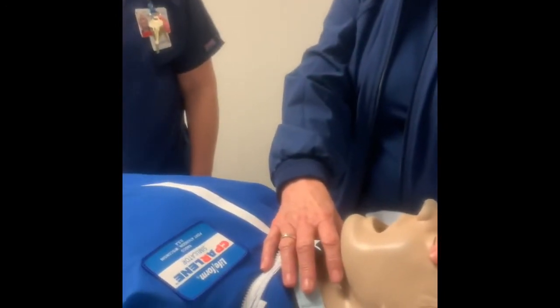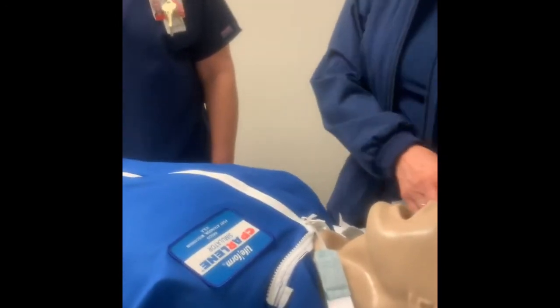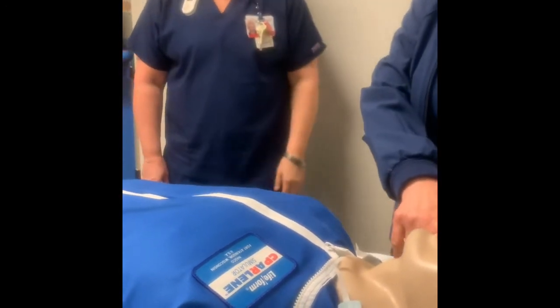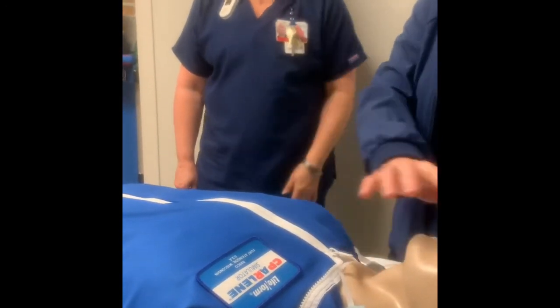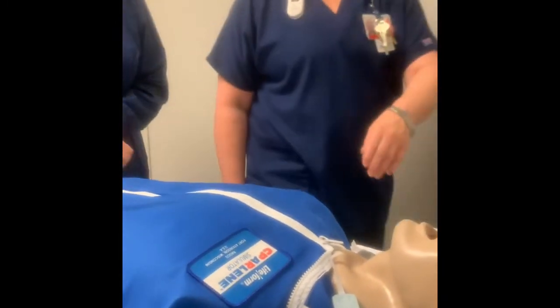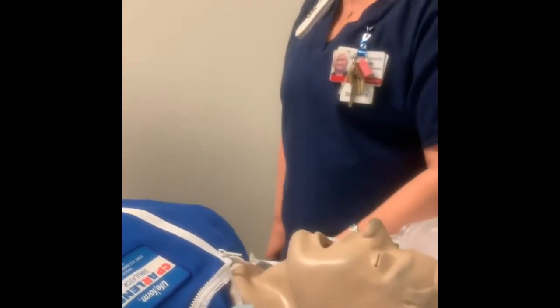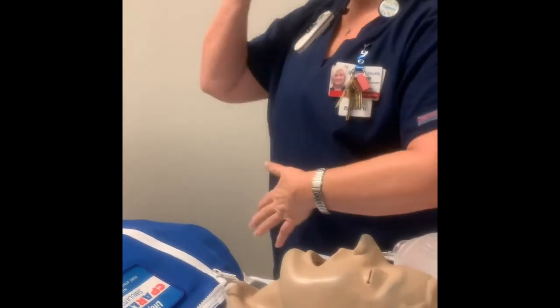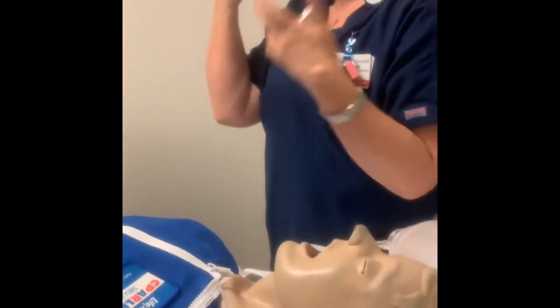A gauze. And then ventilate them. Is it an option to ventilate them here? It doesn't matter either way. You can, but I usually go low, straight to the stoma. Okay, you can cover that. But if they're all swollen back here, because sometimes after radiation and things like that they may be swollen, you can always go to the other. That's the beauty about a trach. You can do upper or stoma.